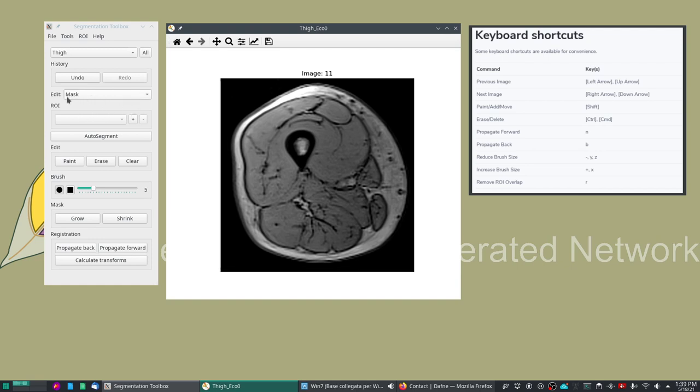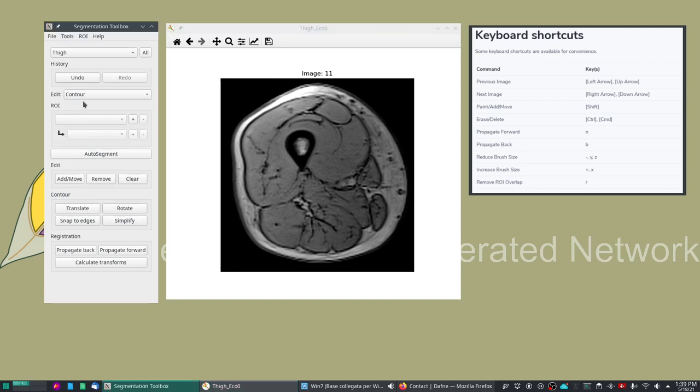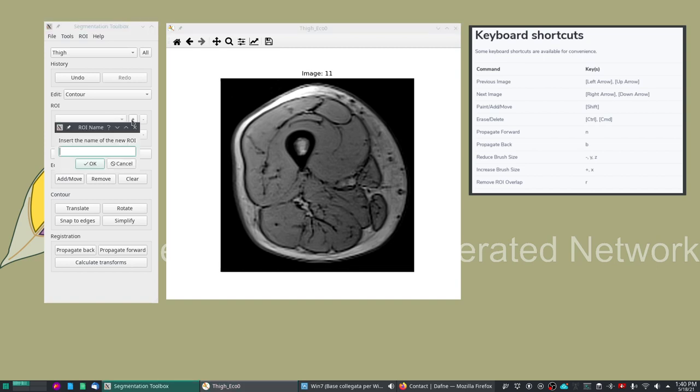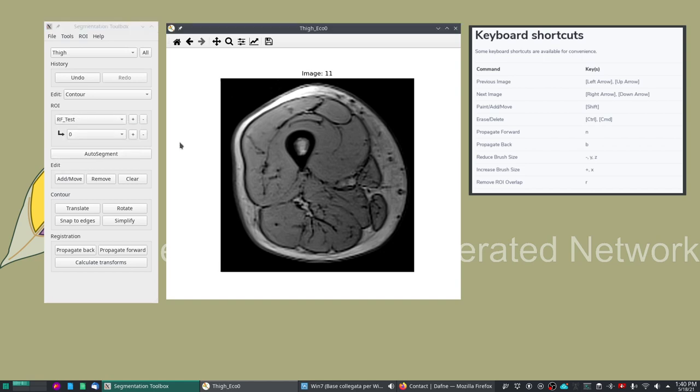First thing to mention, we have two edit modes: the mask mode which is the default mode and the contour mode. In contour mode which is useful for initial segmentation of ROIs we can define some handles around the feature and define an interpolating spline contour. For example, let's take a new ROI on the rectus femoris and we call it RF test.